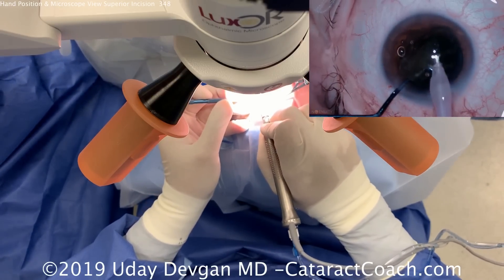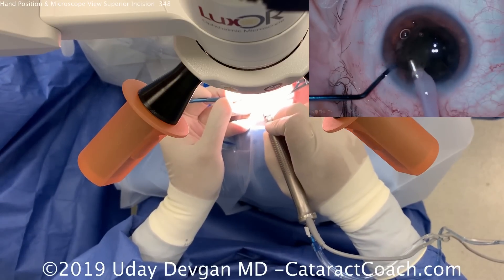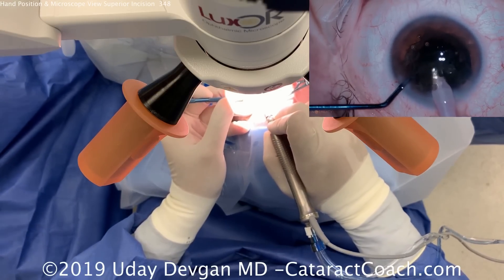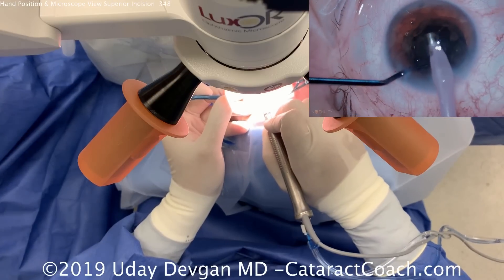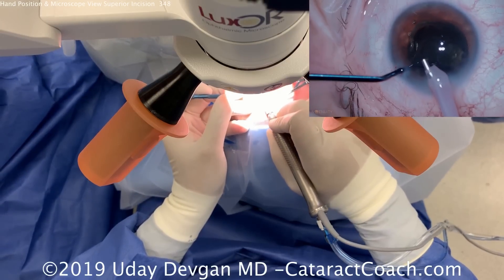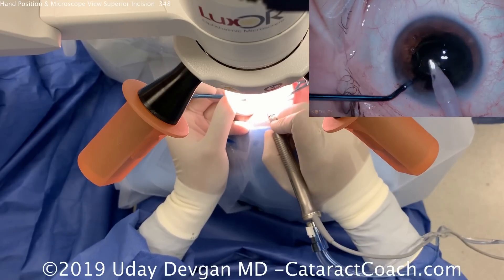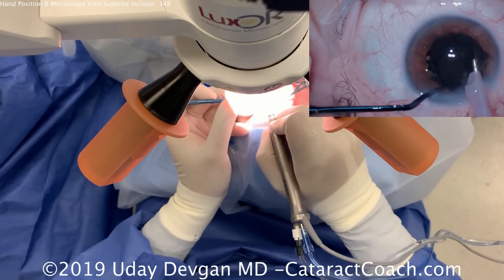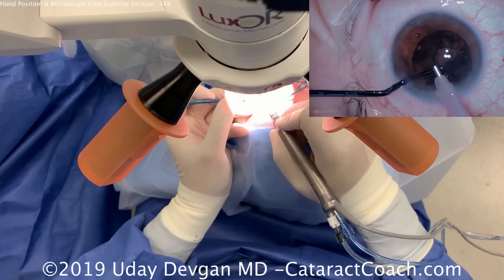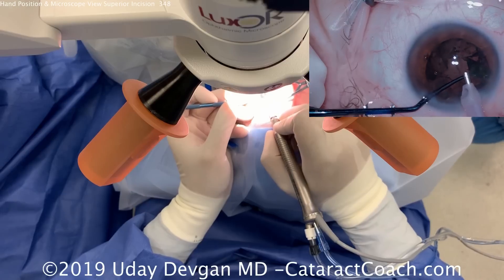Now we can emulsify each half — it's not a very dense nucleus, so it's relatively easier. Look at the position of the FACO probe: it's almost parallel to the floor of the room, not held at too steep an angle. You want to hold it in the same plane as the FACO incision. Notice how we pivot inside the eye, keeping the eye in primary, while outside the eye there's more pivoting than you might imagine. Also note that the cords — infusion tube, outflow, and the electric cord for the FACO handpiece — are all draped over the wrist so they don't enter the surgical field.